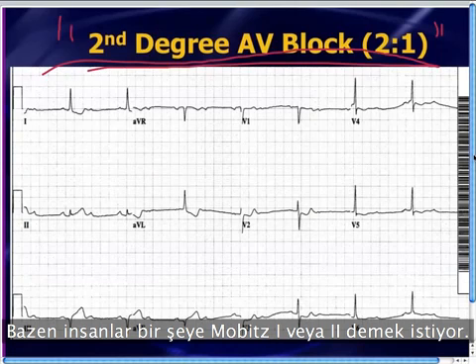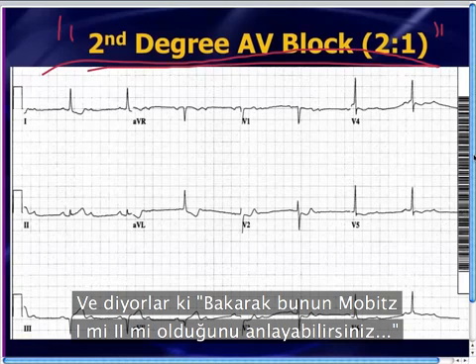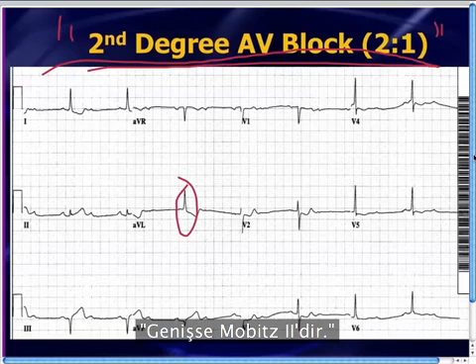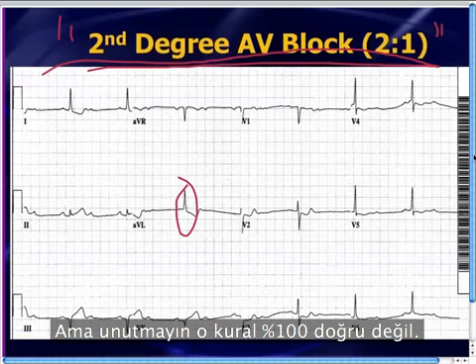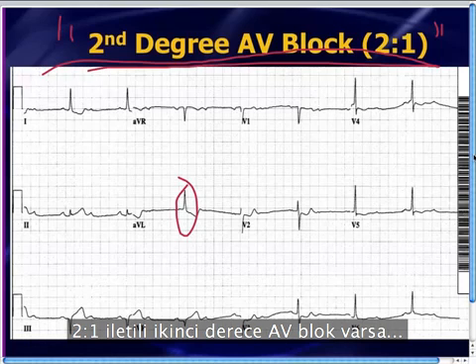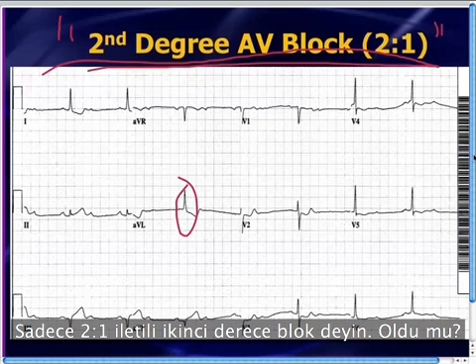Sometimes people really have a desire to call things Mobitz 1 or Mobitz 2 with a 2-to-1 block, and they'll say that if it's narrow it's Mobitz 1 and if it's wide it's Mobitz 2. But remember, that rule isn't 100%. The major textbook authors say: when you've got second-degree AV block with 2-to-1, don't call it Mobitz 1 or 2 — just call it second-degree AV block with 2-to-1.